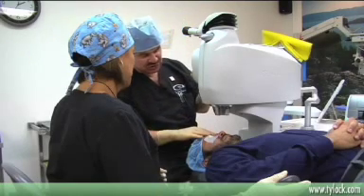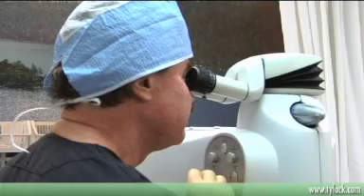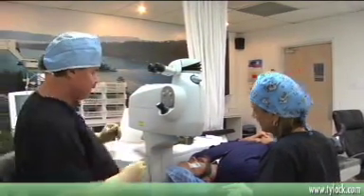Every parameter is controlled in great detail, and typically the flaps are thinner as well. So we're going less depth into the cornea, and we leave more residual tissue that's untouched in the eye with the IntraLASIK procedure. The IntraLASIK procedure has become the standard of practice and the best practices in the country.